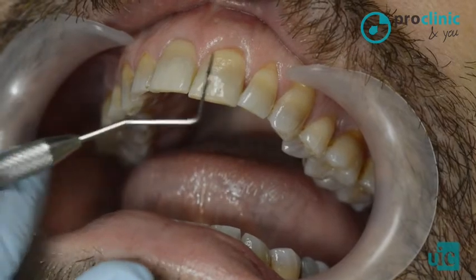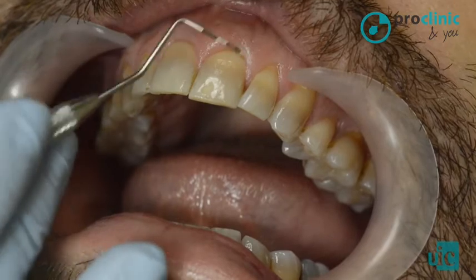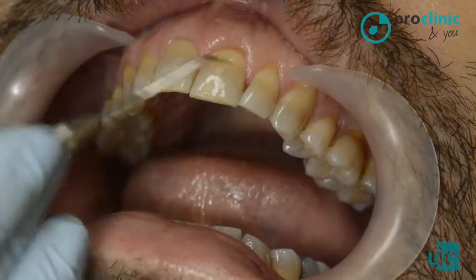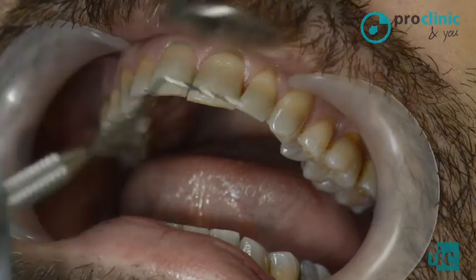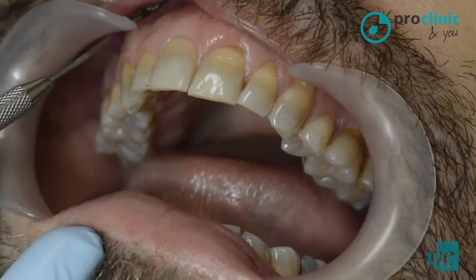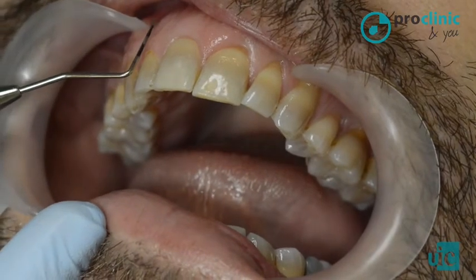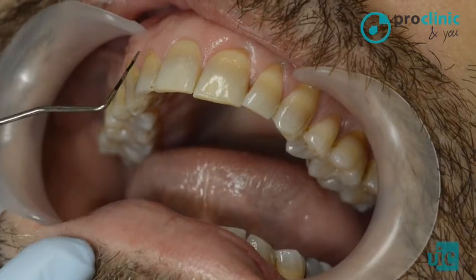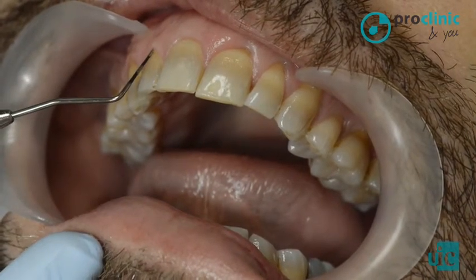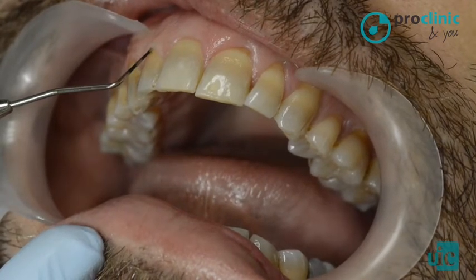The value of the attached gingiva comes from the distance from the gingival margin to the mucogingival line, which in this case is 9 millimeters. And you have to subtract probing depth value, free gingiva, which in this case is 2 millimeters.